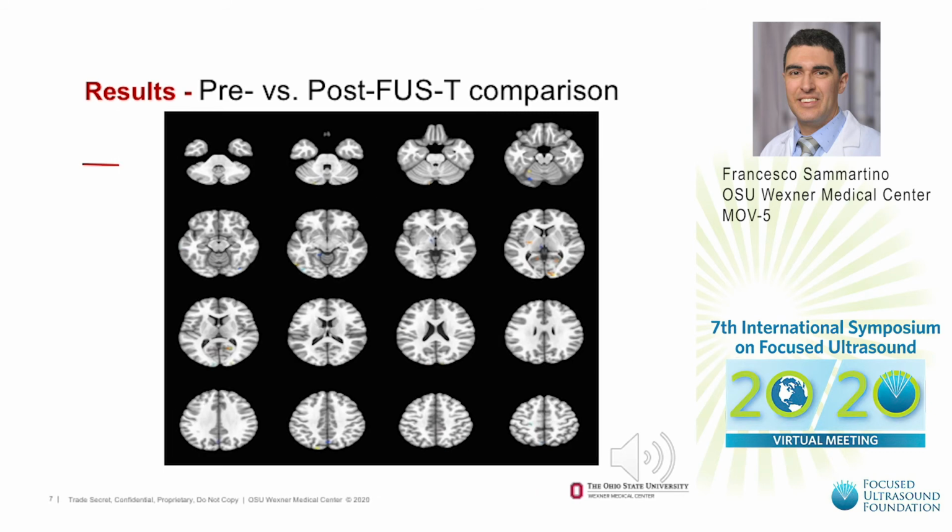And this shows the comparison between baseline and post-focused ultrasound ablation. The blue color signifies a decrease in connectivity, and the yellow-orange color signifies an increase.